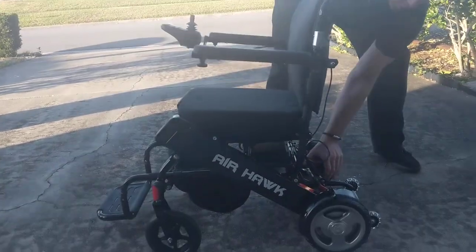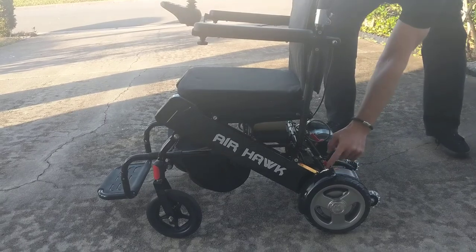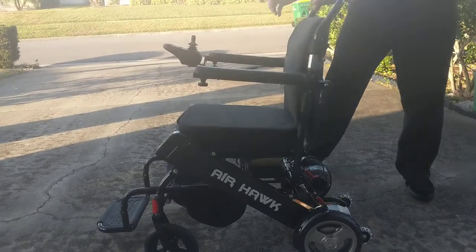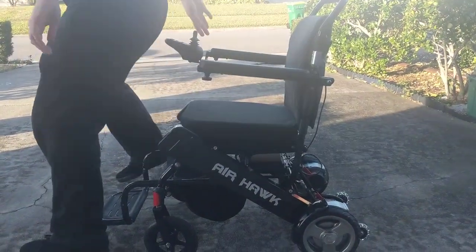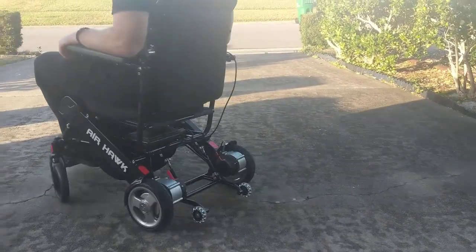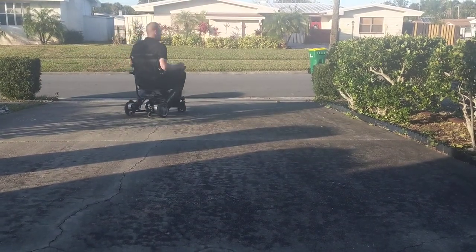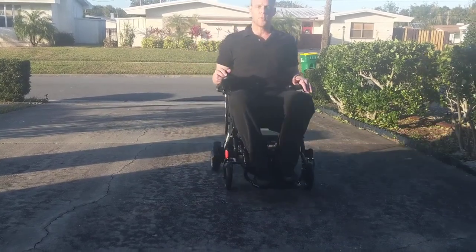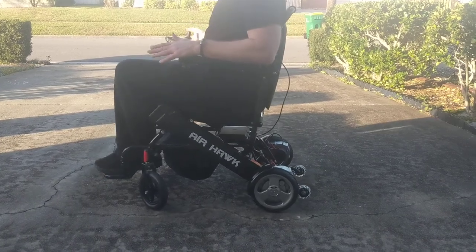We're going to make certain the chair is in electric mode, which can be accomplished with these two red levers that we'll get a closer look at a little bit later on. We're going to turn the chair on and now ride the chair as an electric chair. We have a relative grade and slope in the driveway and good maneuverability.